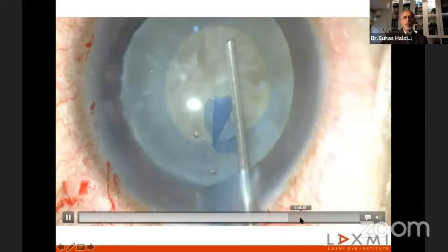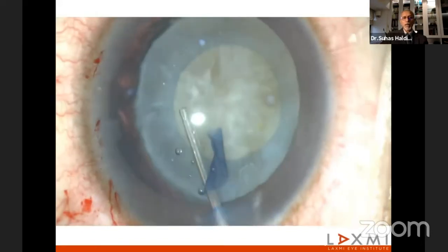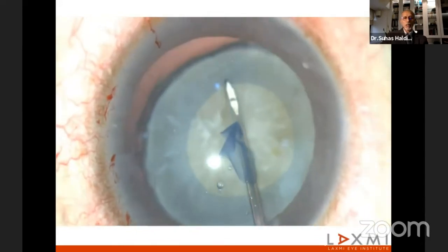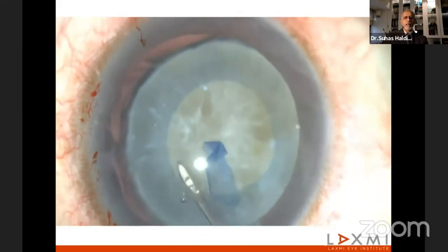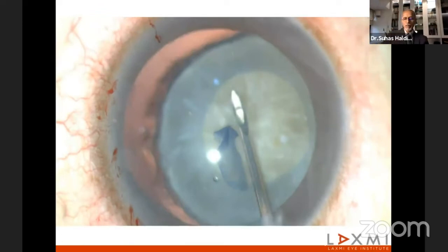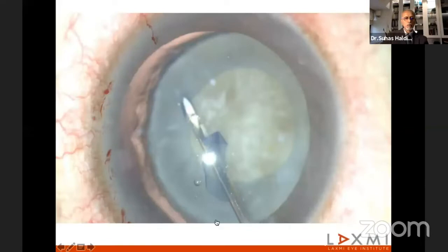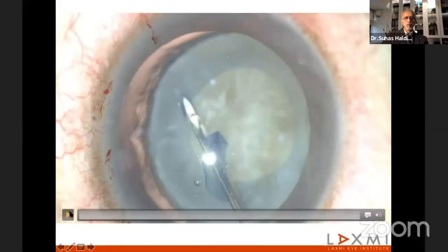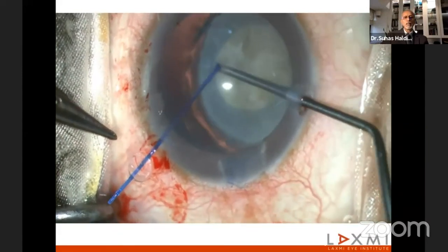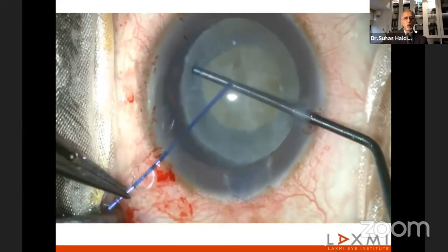But what comes is after that. Now here, in a loose bag, to get a space to go between the rhexis and the nucleus mass is extremely difficult because the bag is loose, it's all the time moving. So sometimes you have to use a 26 number needle. So if you look at this, this is an extremely, extremely tricky situation in most of these extremely loose bags.